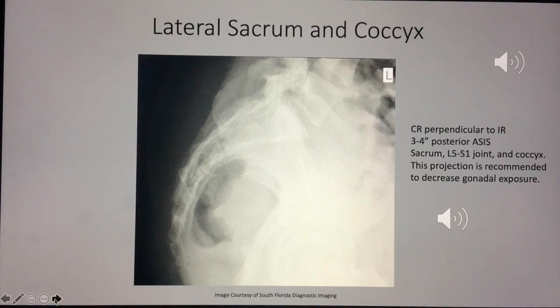For future images, what I will do is center the patient better, open up the collimation lengthwise a little bit, and fix the rotation.